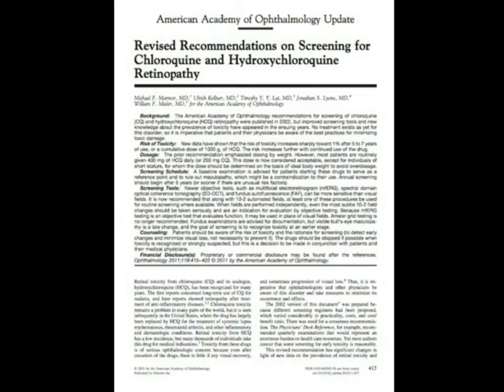Now, there are a number of other things that we actually have access to when it comes to OCT technology. One of the ones that has literally changed in terms of a paradigm shift and really what the new standard of care is, is managing patients who are currently taking Plaquenil. Relatively recently, the American Academy of Ophthalmology actually updated their criteria for the standard Plaquenil exam. And what you realize here is they've now included OCT scans in their requirements or in the standard of care for these patients.